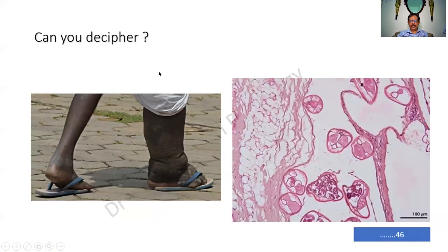I hope you are able to understand this. So this is the elephantiasis that we have been talking about. And this again is not a problem for you as undergraduates, though rarely it might be kept. But then I am finding the cut surface of the organism. And these are all in the lymphatic channels. The empty space behind is a lymphatic channel.